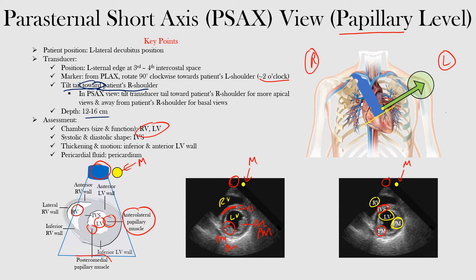We can also visualize the different portions of the left ventricular wall. In this case, we can see the inferior and the anterior wall. So let's orient ourselves here. We have the left ventricle, which is this here. Then we can see the anterior wall, which would be this portion. And we can also see the inferior wall, which would be here.